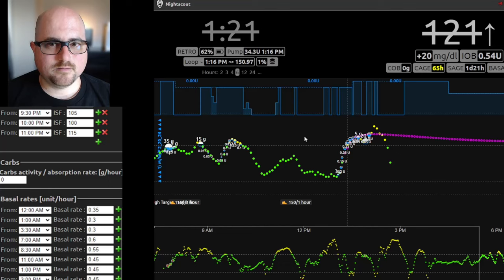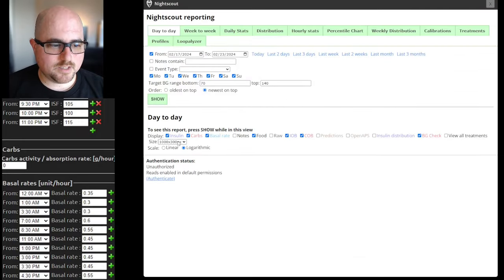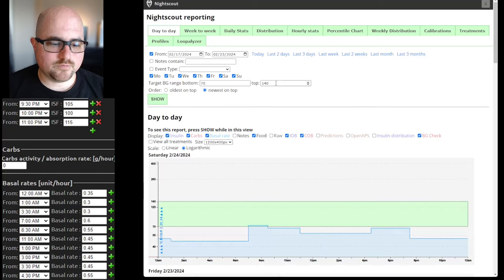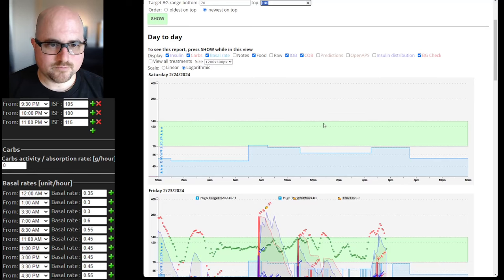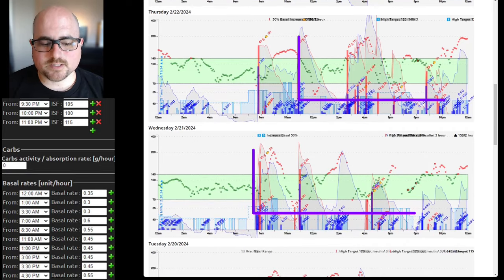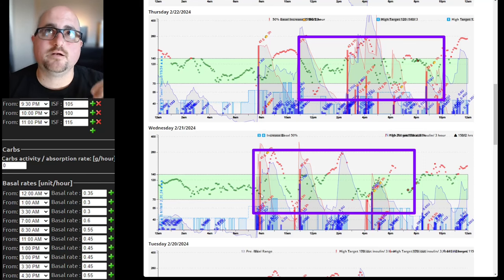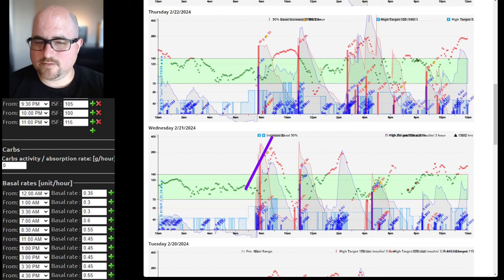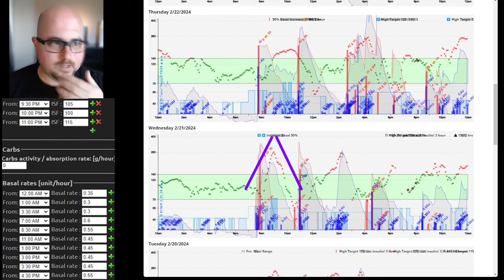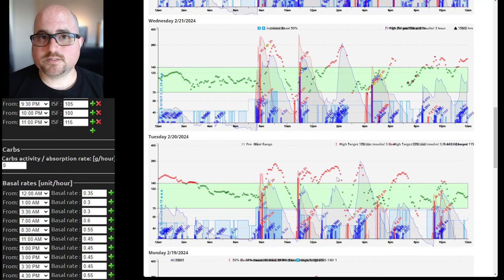I had some weird things happen last night and I did change some stuff. So let's take a look and see what was changed since we're doing a little investigation here. We'll take it to the week view. Make sure insulin on board and carbs on board boxes are checked — and you're running 70 to 140 high. That's just fine. The green bar is 70 to 140. Let's look at the day before. Thursday and Wednesday look a lot more like what I would expect a high basal to be contributing to lows — and a weak carb ratio paired with a heavy basal, where you shoot up because you don't quite have enough food in the bolus, and then you crash back down and you're catching it.